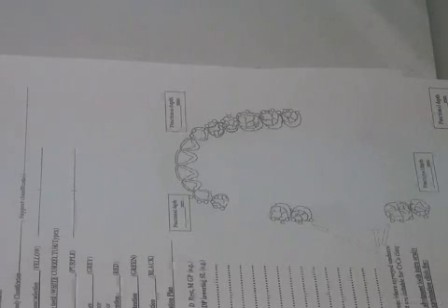Can I still use the acrylic? Yes. Do I need to change the open lattice? Yes, I'd rather put mesh. Okay? So, 2 things we changed from our design. The mesh for the resin retention area, and major connector now, I could put a palatal bar.